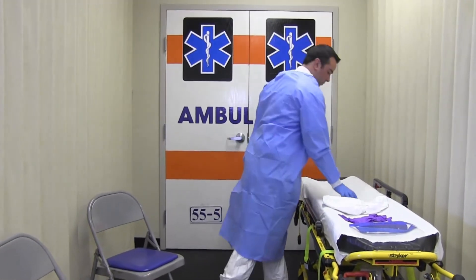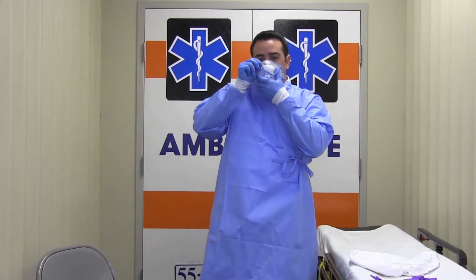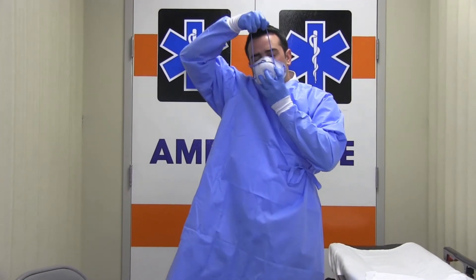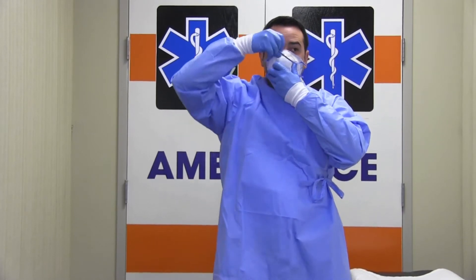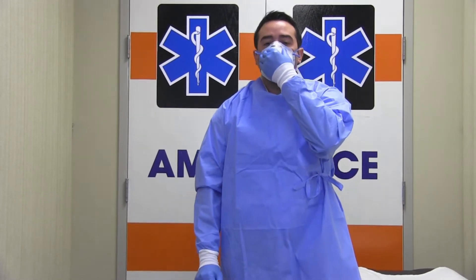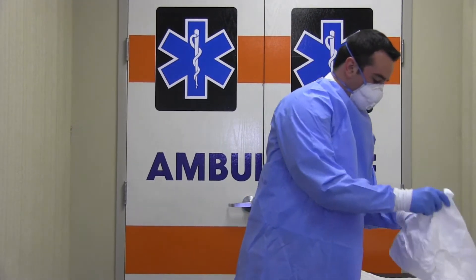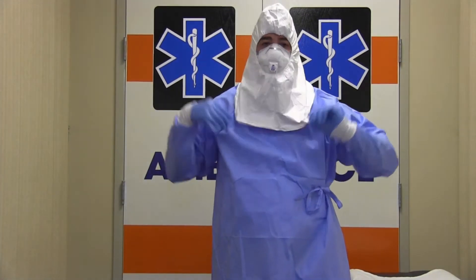Now you will put on your N95 respirator. Place the mask over your face, then move the lower strap over your head, followed by the upper strap. Press the nose piece to conform it to your nose and complete a user seal check. Over the N95 respirator, you will now place a surgical hood that covers all of your hair and your ears. Ensure that it extends past the neck to your shoulders.